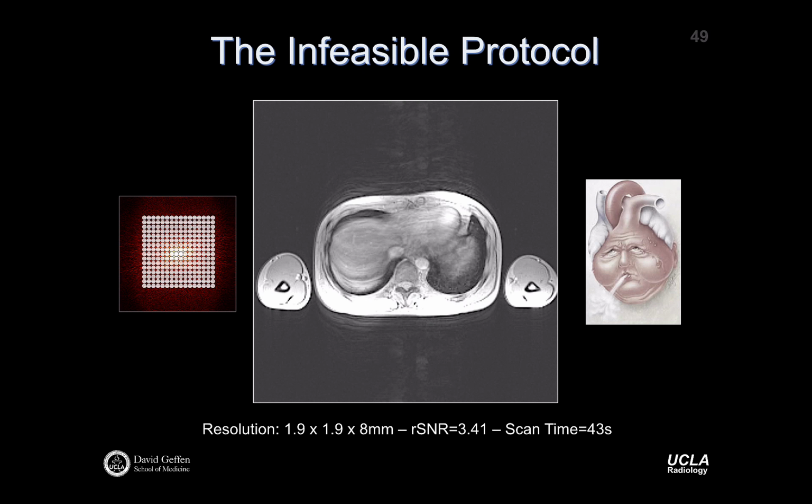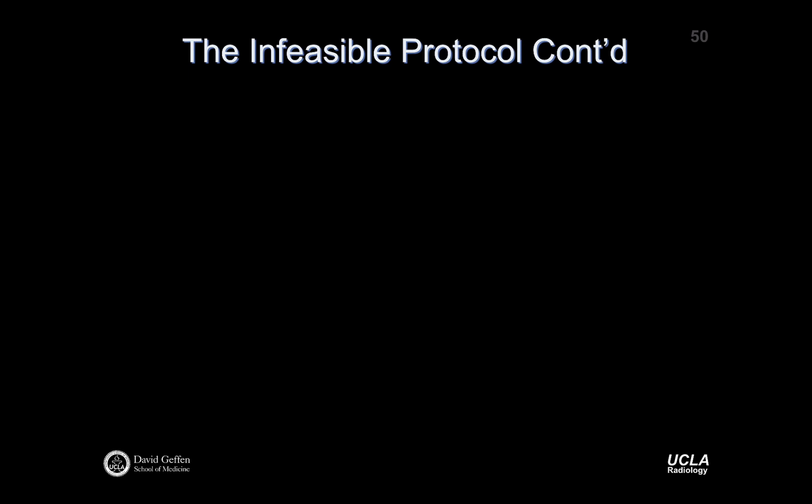In the frequency encoding direction, remember, I can shrink my field of view without aliasing artifacts, right? So I can make this not quite arbitrarily smaller, but smaller. And for example, chop off the arms, and that won't be an aliasing artifact because this is the frequency encoding direction. Aliasing happens in the phase encoding direction. If I make my field of view too small, then I'll have aliasing in the phase encode direction. So there are some limits there, more so in the phase encode direction than in the frequency encode direction.